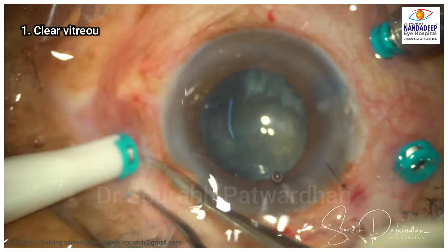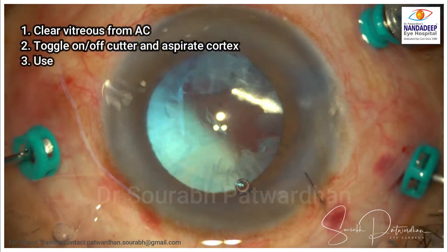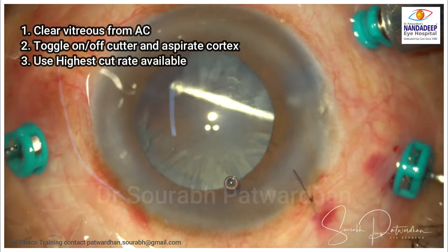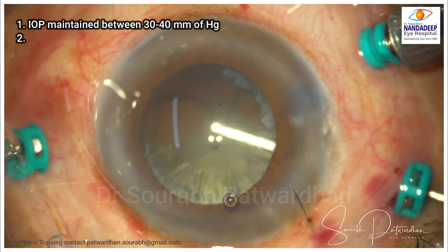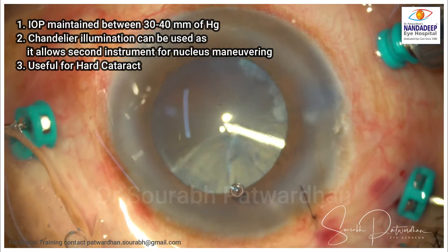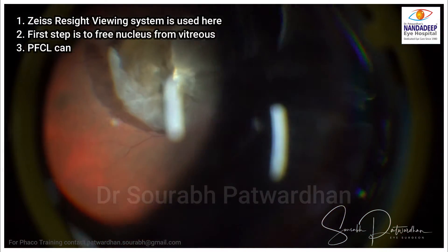The first thing to do is clear the vitreous from the anterior chamber. First clear the vitreous and let the nucleus get free, then toggle on-off the cutter. When you switch off the cutter, you can use aspiration only to aspirate the cortex. IOP is maintained throughout at 30 to 40 mmHg. I am going to use the Constellation machine here. Chandelier illumination can be used for good visualization, and you can use your endoilluminator for manipulating the nucleus, particularly in hard-grade cataracts.